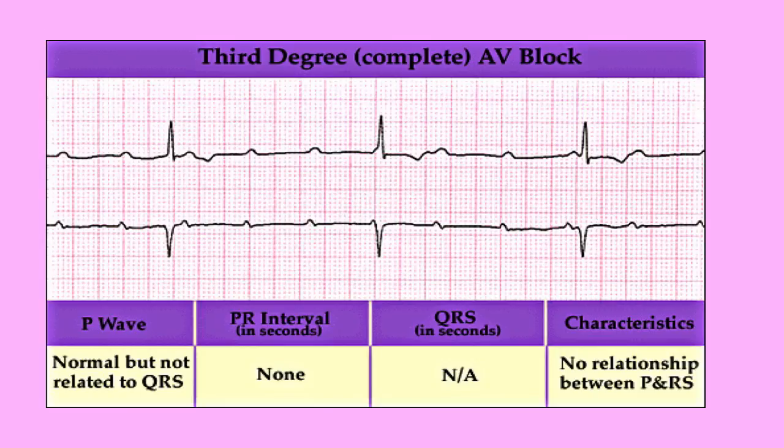The clinical implication of this is that it's always corrected with a pacemaker. Patients in third degree or complete AV block will always get a pacemaker implanted to take over the initiation of their heartbeats. If you look at page 41 at the bottom, you can see a straight up and down spike before every QRS complex, and that's the pacemaker pacing the beat. That pacemaker is pacing right in the ventricles and initiating that heartbeat right in the ventricles with that spike.